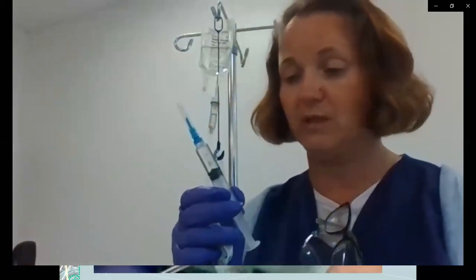So next up, we're going to prepare to go into our patient room. Supplies that we need are going to be our alcohol swabs to administer. We're going to need a saline flush for before and a saline flush for after we give the medication. After you've pulled up your medication, like I just did, label that syringe. You always, always, always label syringe. Don't carry around syringes that don't have labels on them.